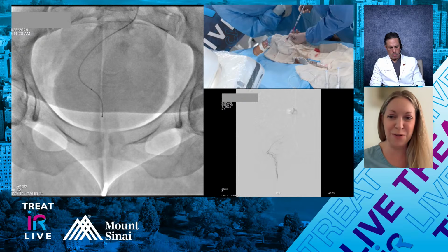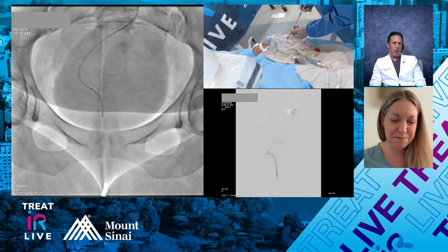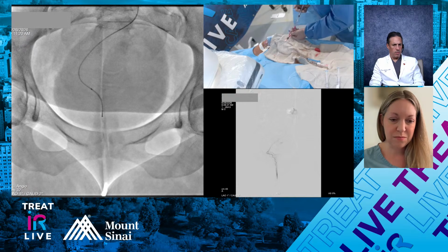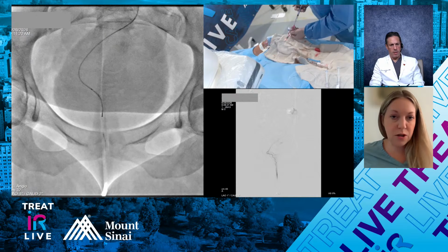This is not beneficial physiology for us in this situation. I have a 1 cc of saline. Do you have another one, 1 CC? As you guys are putting the particles in, you said you're going to use 7 to 9. Is that right, Jay? Yeah, I'm only going to give 1 cc of it. Okay, so you're going to give a small amount, starting with the smaller.